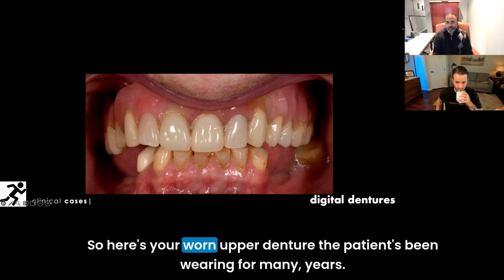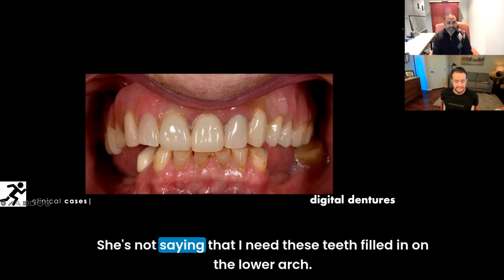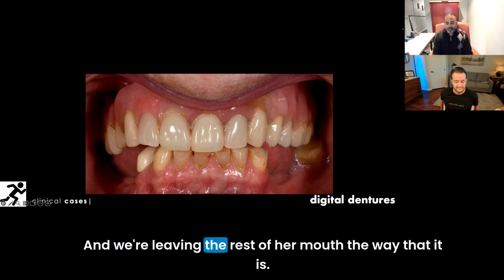So here's your worn upper denture the patient's been wearing for many, many years. She's missing a lot of teeth on the lower arch, but her main concern is just, I don't like the upper denture being worn. She's not saying that she can't function. She's not saying that I need these teeth filled in on the lower arch. And we obviously went through all the different potential treatments that we could offer her. But her treatment plan at this time is to really just change the upper denture, and we're leaving the rest of her mouth the way that it is.